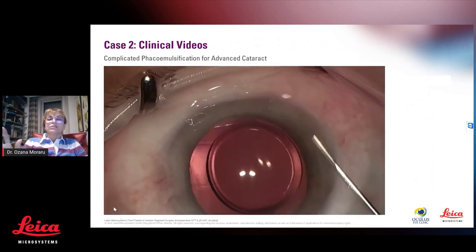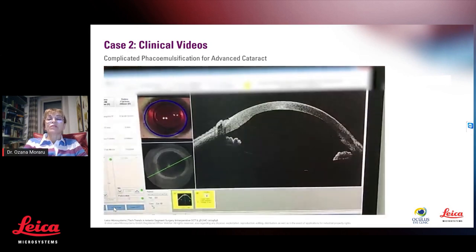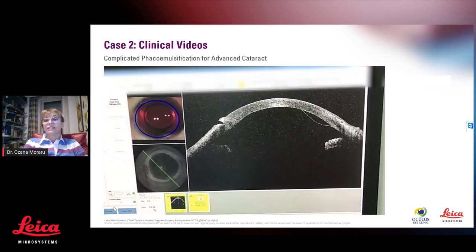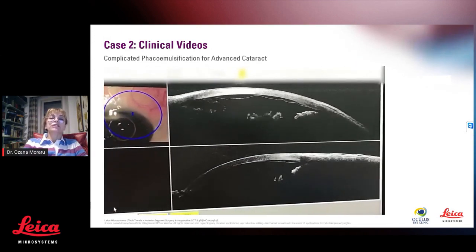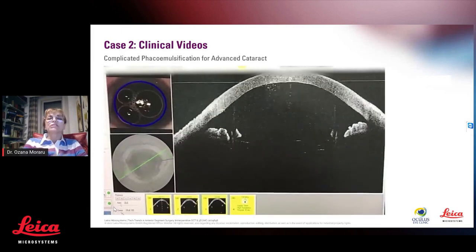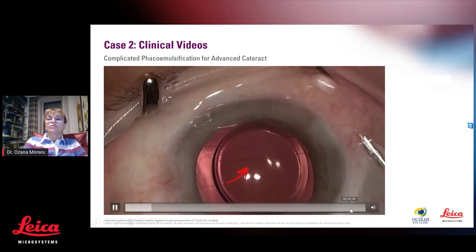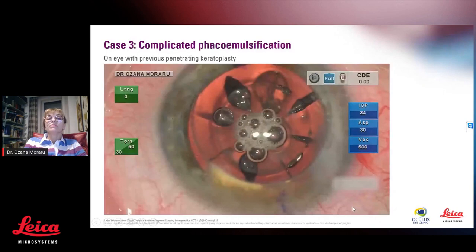I'm at the end of the surgery, and this is that tiny, fine line highlighted by the red arrow, which I presumed was an accidental descemet detachment, and indeed the EnFocus confirmed this incident in one third or almost one half of the descemet. I injected air, but it was not enough. The EnFocus showed me that it was not enough. I injected more, and at the end I checked once again with the EnFocus OCT, and I could see that it was completely attached.